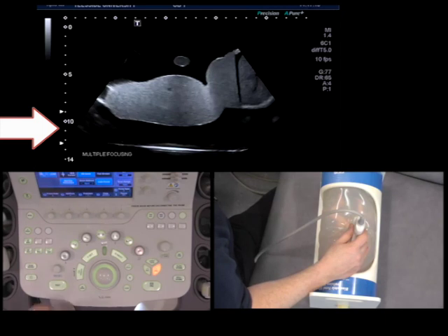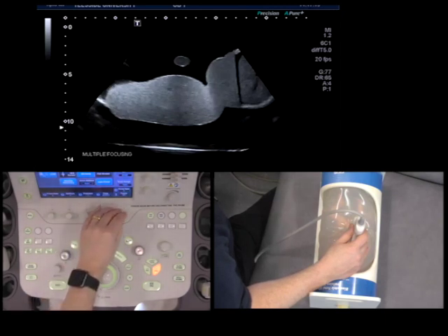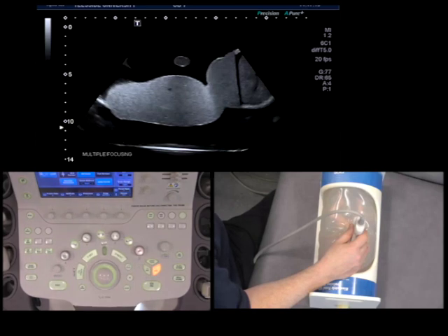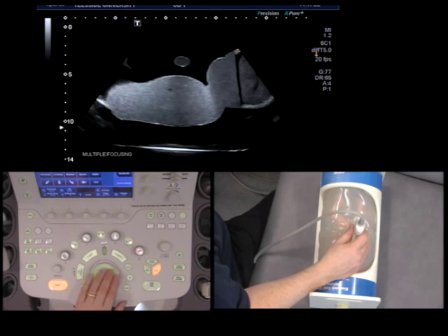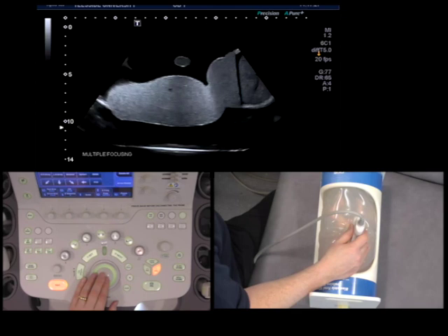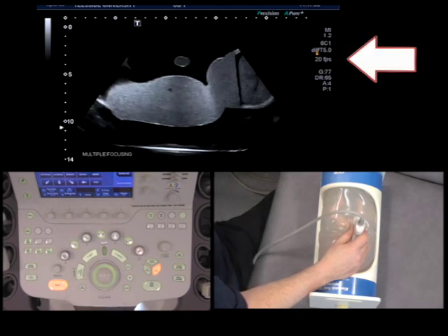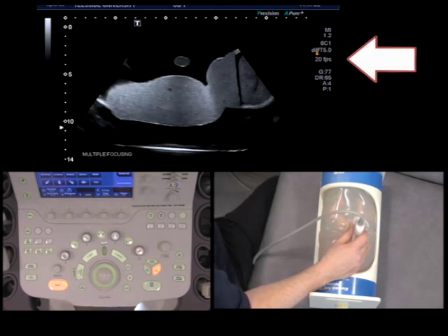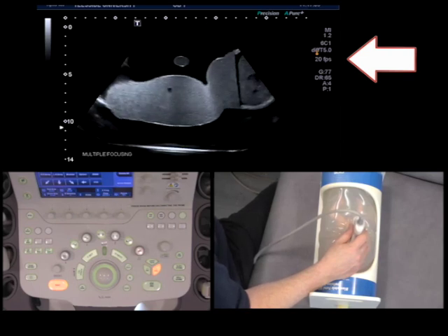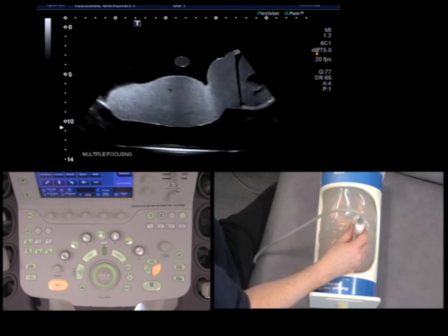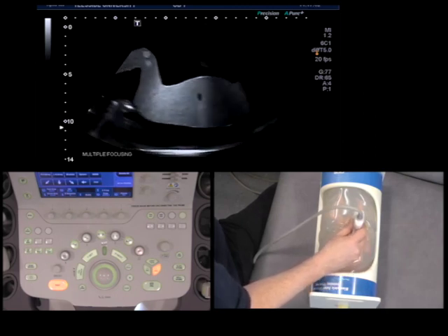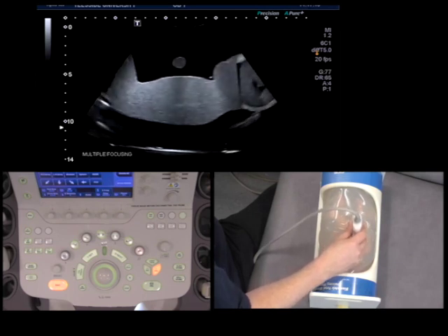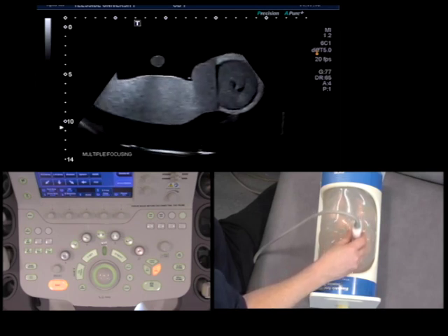There is a trade-off, though. If I come back to the one focal zone and look over here, we'll see that the frame rate is presently set at 20 frames per second. As we discussed in the first video, if we have a frame rate of 20 frames per second, we have a real-time moving image. So as I move this probe, we can see that the image is keeping up with my hand.